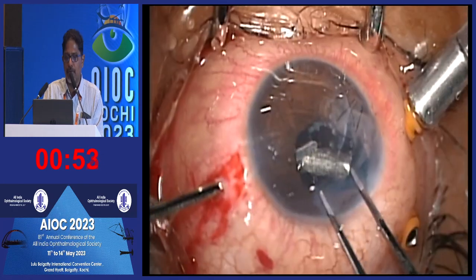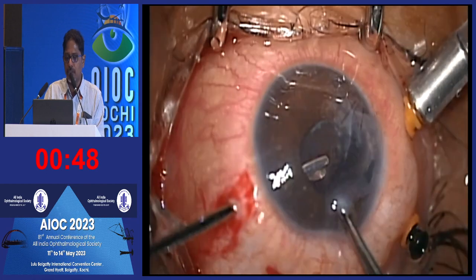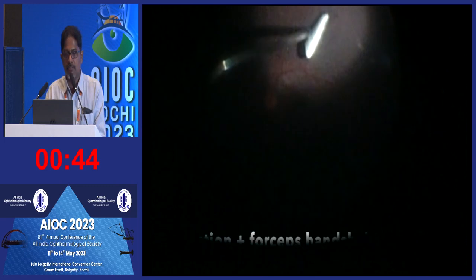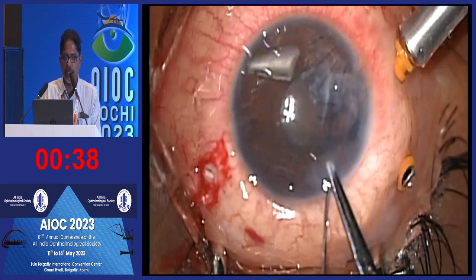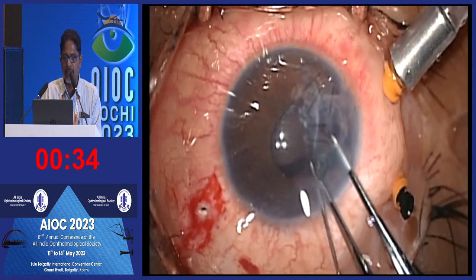It tends to keep on falling. I almost dropped this 8 times before I was able to remove it. Luckily, there was no injury to the retina. So oil helps to prevent all these bad things from happening. Oil can be used as an adjunct to prevent retinal injury, maintain the globe's intactness, as well as keep the media clear when removing non-magnetic foreign bodies. It's a very helpful adjunct.